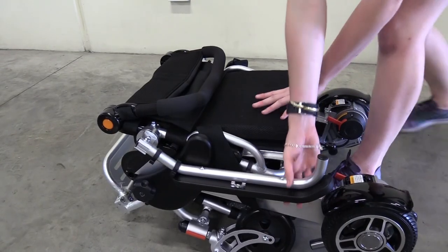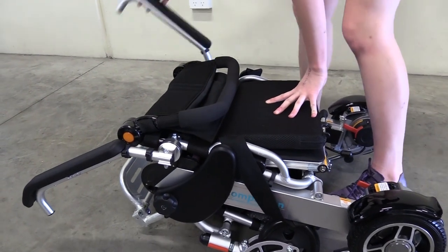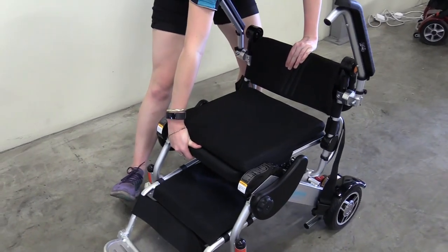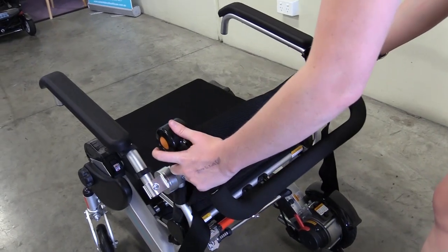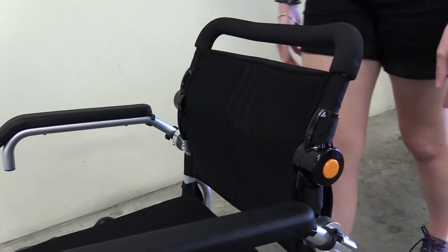To unfold your wheelchair, move the armrests up as shown. Have a firm hold on the seat and the backrest and pull the chair out until you hear a click. Move the armrest down. Unfold the backrest by pulling up. To make it straighter, push the buttons on the side and push up.